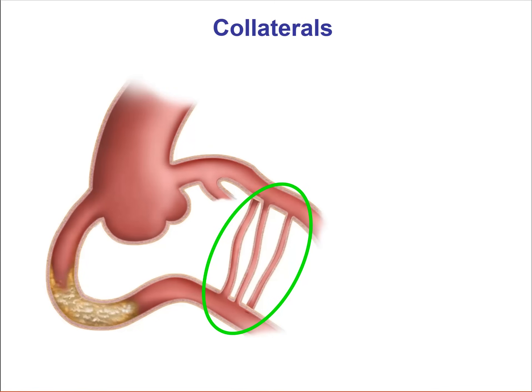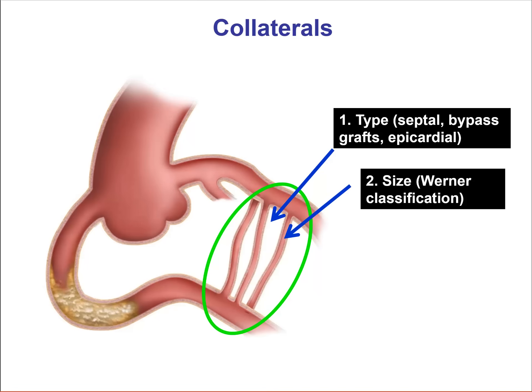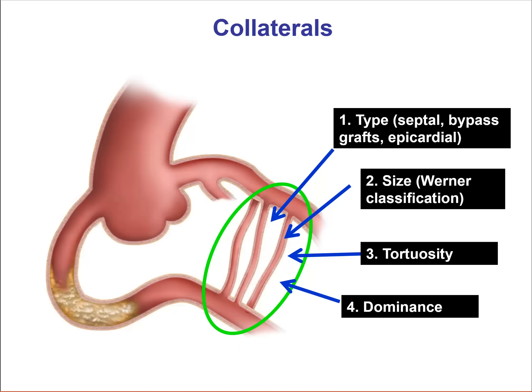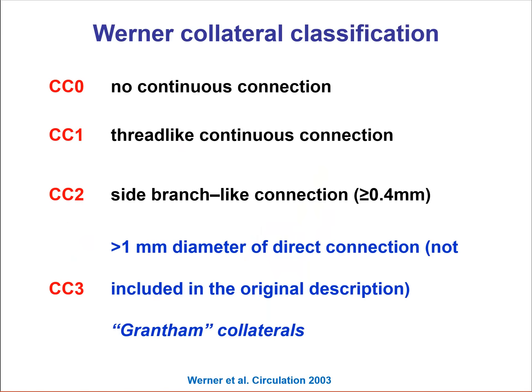Finally, we look at the collateral vessels: whether they are septals, bypass grafts, or epicardials; the size using the Werner classification; whether they are straight or tortuous; what is the dominance — meaning the dominant source of blood supply to the occluded segment. This is very important because if there's a single collateral feeding all the distal territory and that becomes occluded during crossing attempts, severe ischemia and/or arrhythmias may occur. Finally, we look at where the collaterals touch down the distal vessel — the angle and location of entry — and we want the entry to be further away from the distal cap, so there's enough room for equipment to provide additional support during crossing attempts.